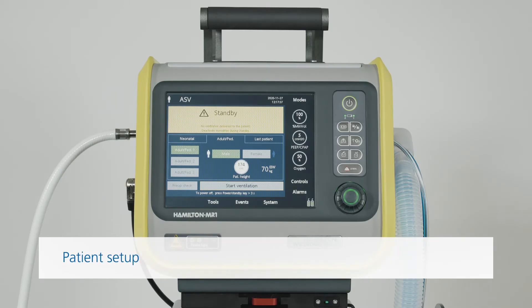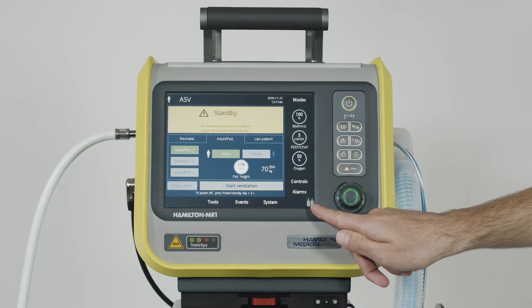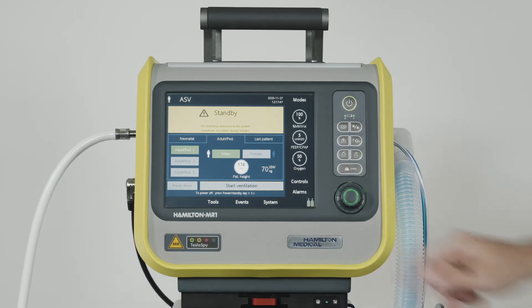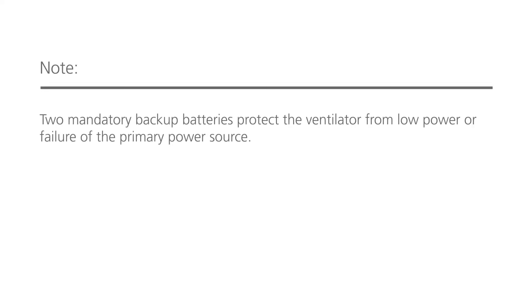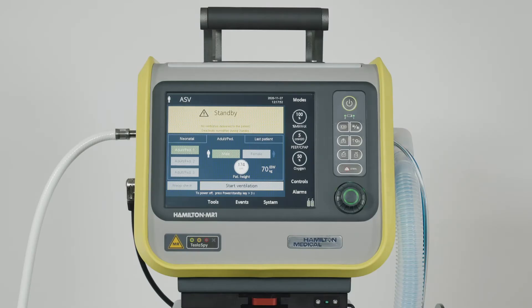Before you connect a new patient to the ventilator, make sure there will be enough power during ventilation. Check the icons in the bottom right corner. The green part of the battery symbol shows you how much of the battery is charged. We recommend that the batteries are fully charged before you start ventilation.